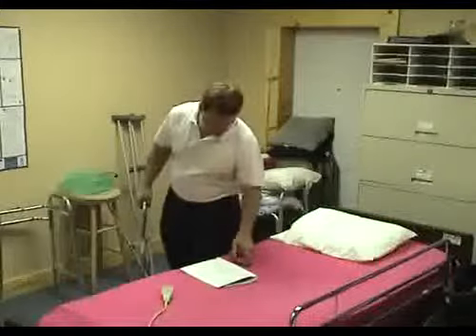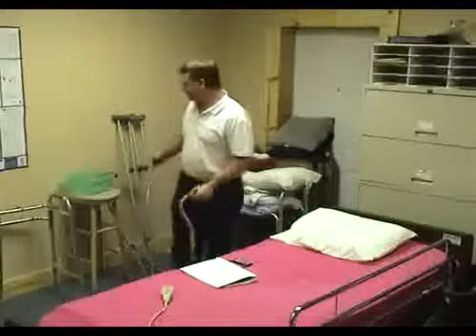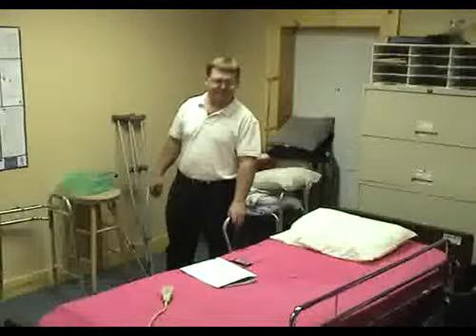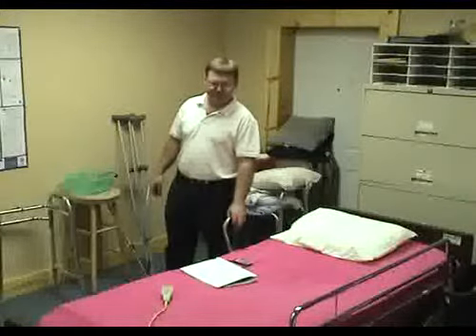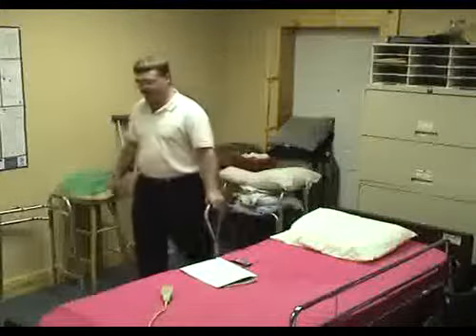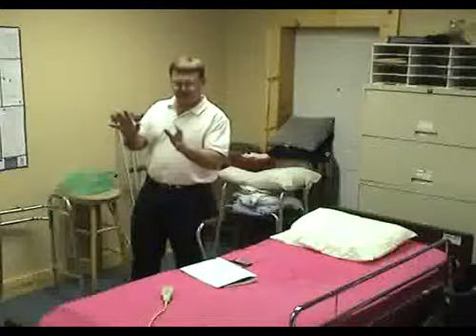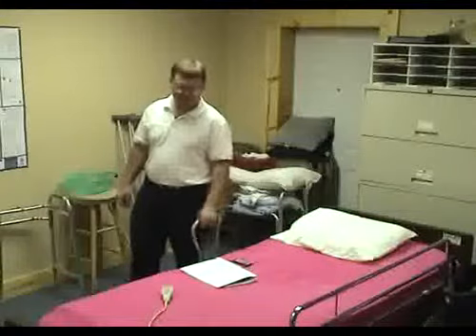Okay, same thing with the cane as with the crutches, and even the walker. Up with the good, down with the bad when you're doing steps. The best thing is for you to be behind them if they're going up the steps. If they're coming down the steps, the best thing is for you to be in front of them. I would keep my hands out, maybe holding their hand. You could also go underneath the arm as you're coming down with them or going up with them. That would also be safe.